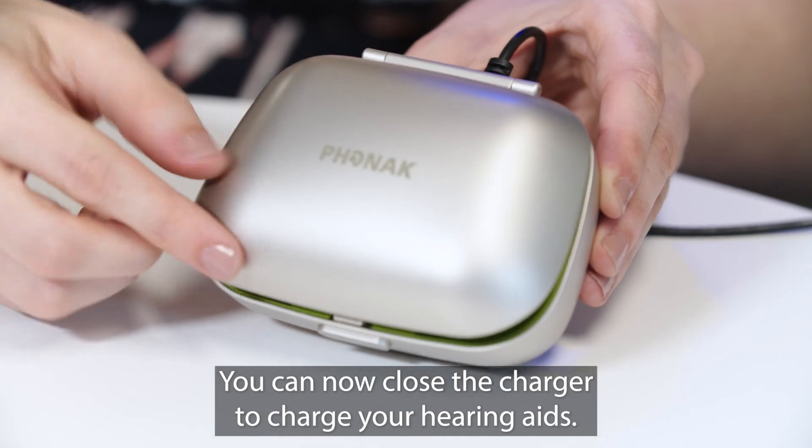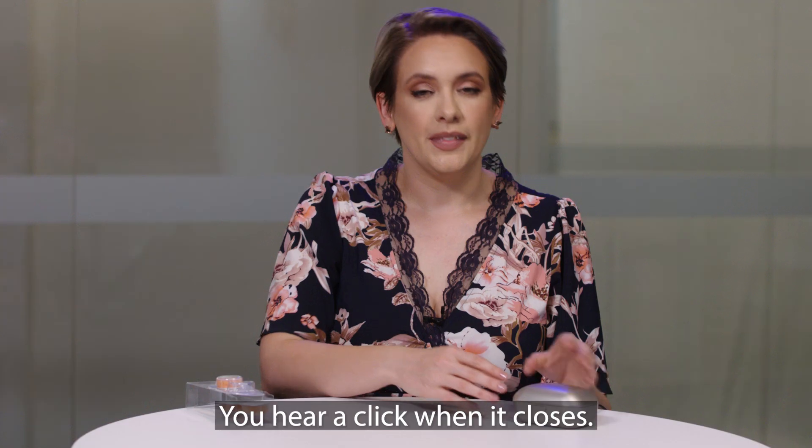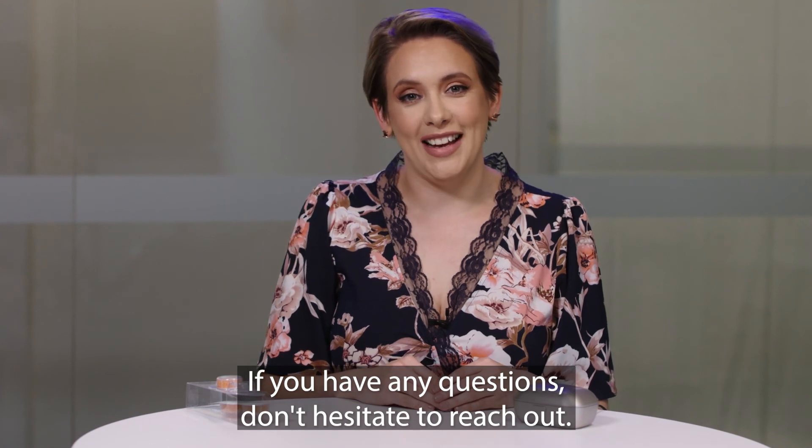You can now close the charger to charge your hearing aids — you'll hear it click when it closes. If you have any questions, don't hesitate to reach out.